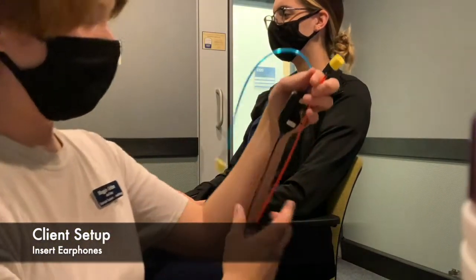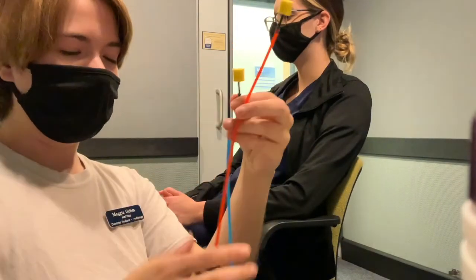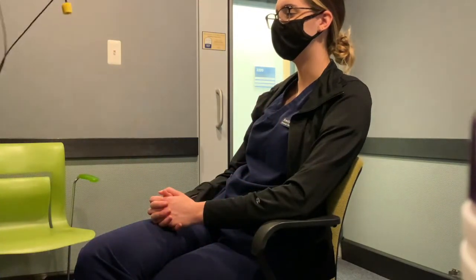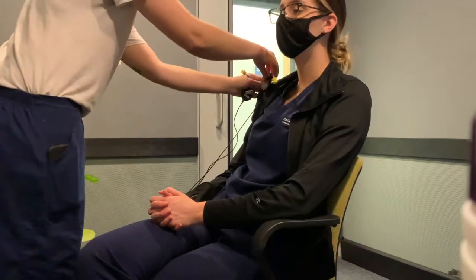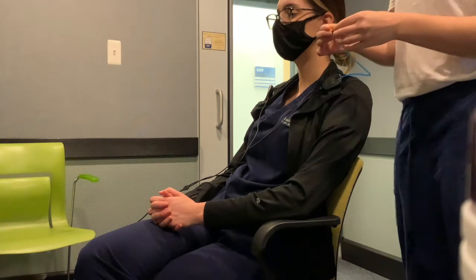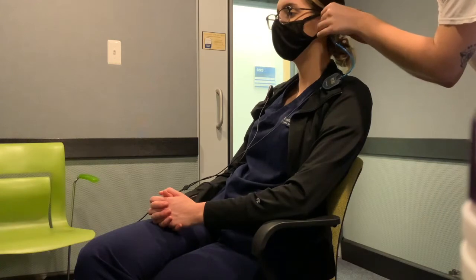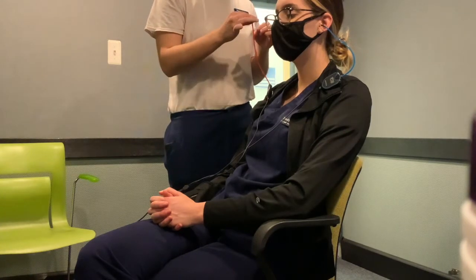Okay, so for insert earphones, you're going to want to put the foam tips on the end of the wires, and then you'll go ahead and clip the little clips to each side of the client, making sure to put the red transducer on the right side of the client and the blue on the left side. You'll take the foam, roll it between your fingers, and just like for otoscopy, you'll pull the ear a little up and back as you insert it into the canal. Make sure it's snugly fit so that sound won't escape. It'll go directly into their ear. And same with the one on the right.